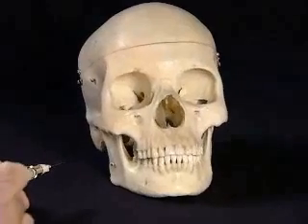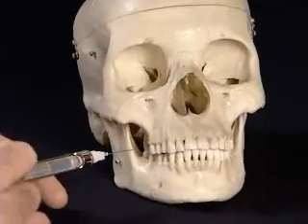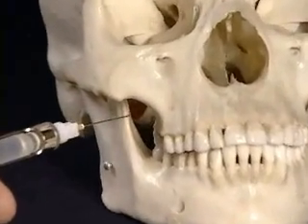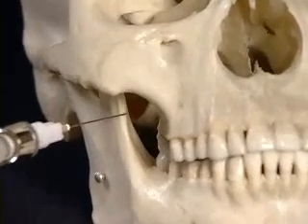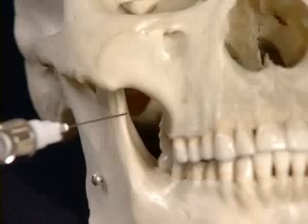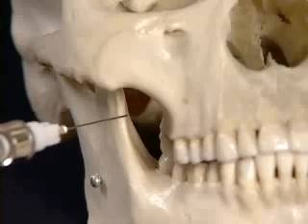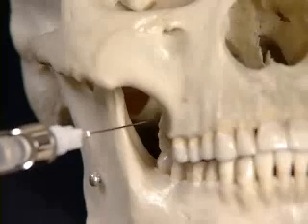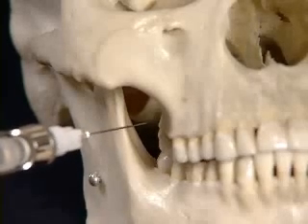It's important to begin with knowing where the anterior border of the ramus is, and that should be palpated, and then the coronoid process noted. The coronoid process marks the lateral border of where you would want to insert the needle, and the needle insertion goes between the coronoid process on the lateral and the maxillary tuberosity on the medial, and the point should be selected in between those two sites.